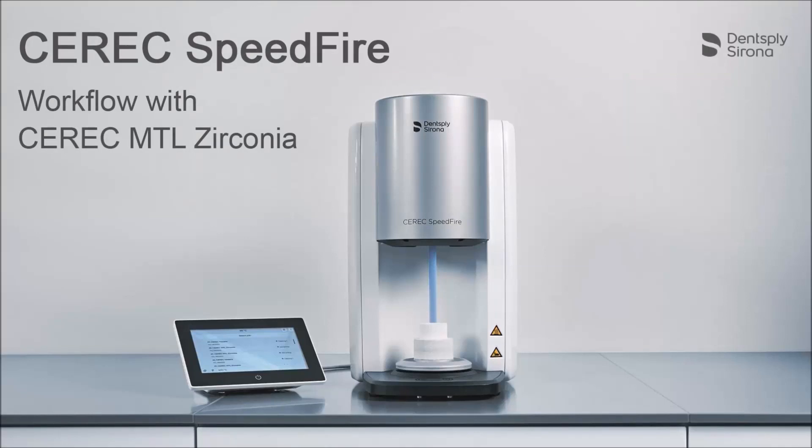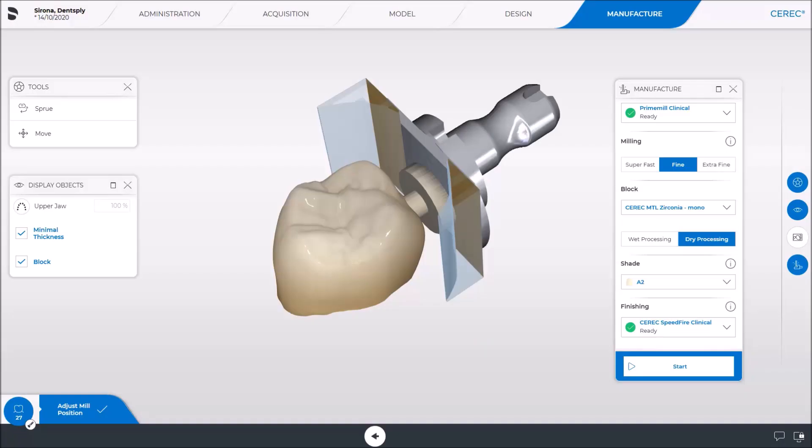Welcome to this video tutorial on the CEREC Speedfire. In this video, we will demonstrate the workflow for a CEREC MTL Zirconia restoration from the manufacture phase to final completion. We start in the last phase of the CEREC software, the manufacture phase.